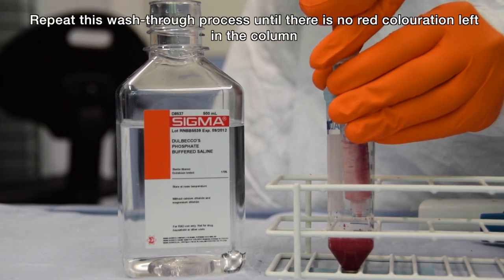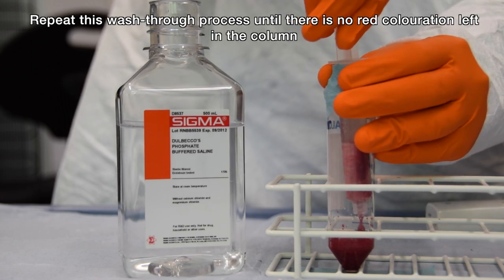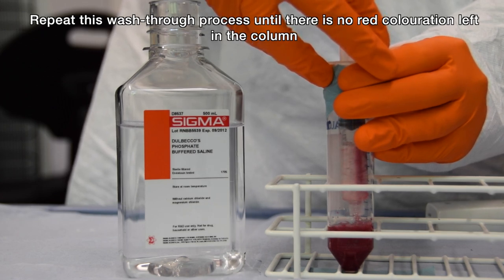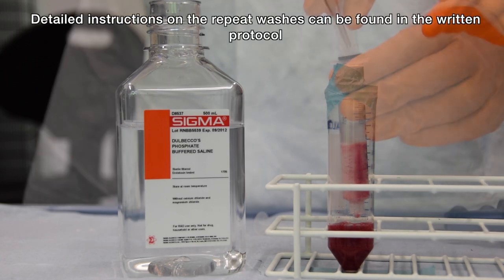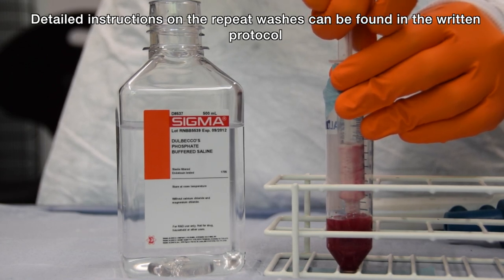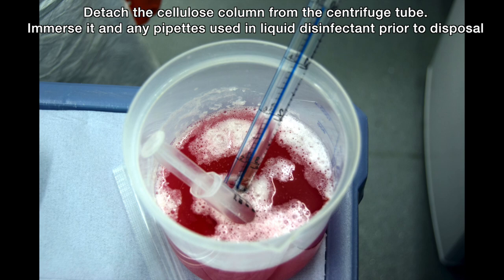Repeat the wash through until the column is clean and there is no red coloration. Detach the cellulose column from the centrifuge tube and immerse it in liquid disinfectant prior to disposal.